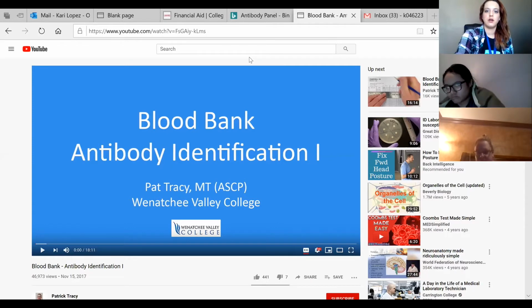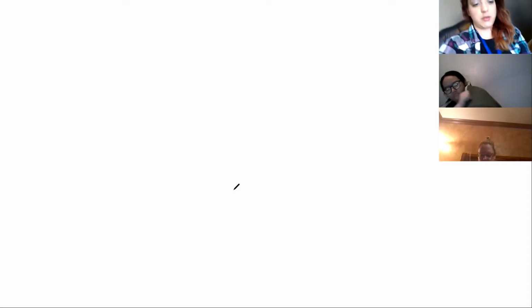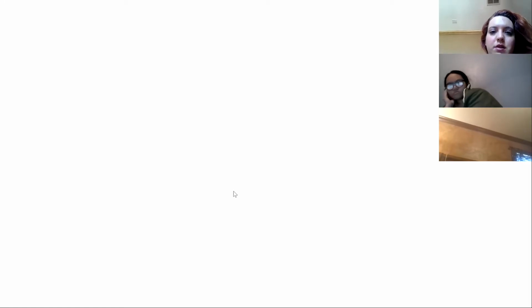So I'm going to give this whiteboard thing a shot, and y'all are just going to have to bear with me. All right. If this doesn't work, I'm going to go back to the, what's it called? Word document. I gotta get over here. Just killing me. Stop sharing. Okay, so I'm trying. Text antibody.